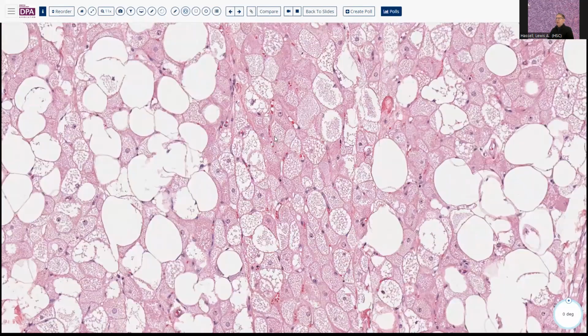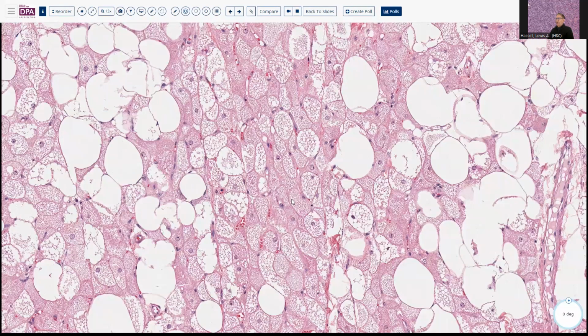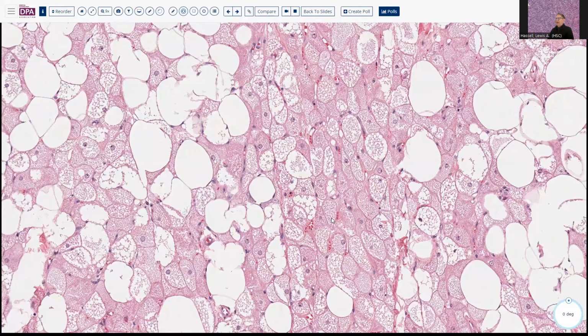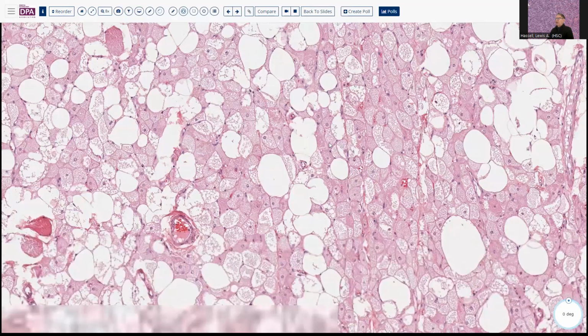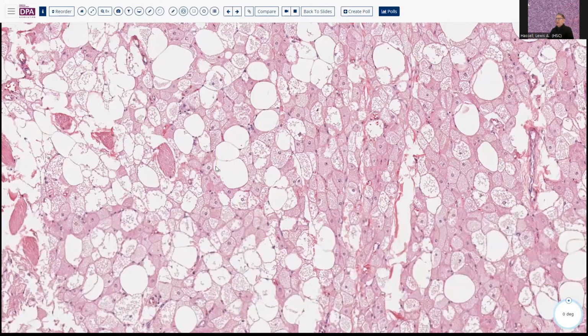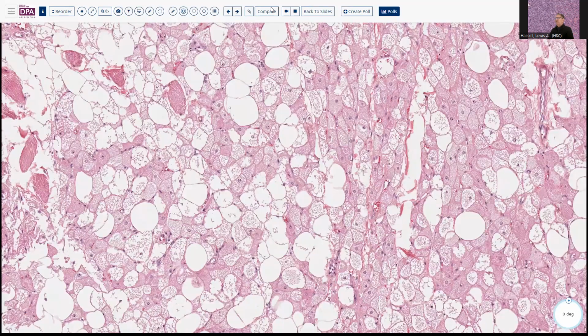And that's because we have a little more cytoplasm here, less lipid in these cells. And you can see very nice uniform nuclei with this granular, foamy appearing cytoplasm that's characteristic of brown fat. And no alteration to the vasculature. There's no prominence, a typical array, a mixture of small, medium, and large sized vessels would be appropriate to find in one of these lesions.